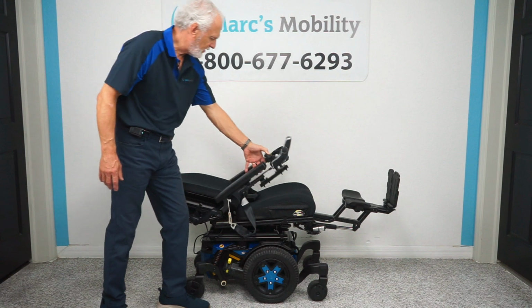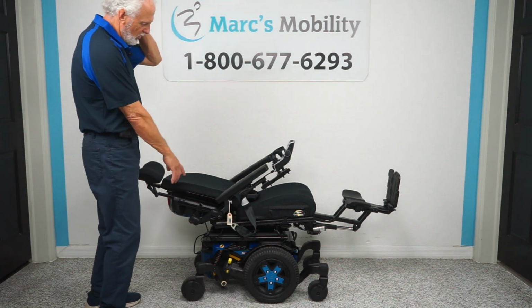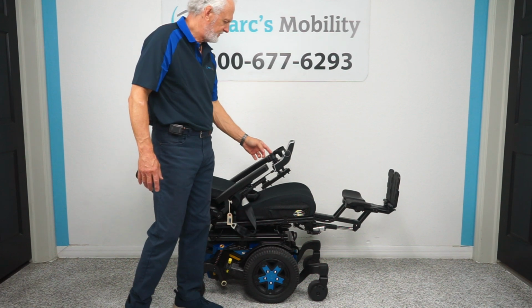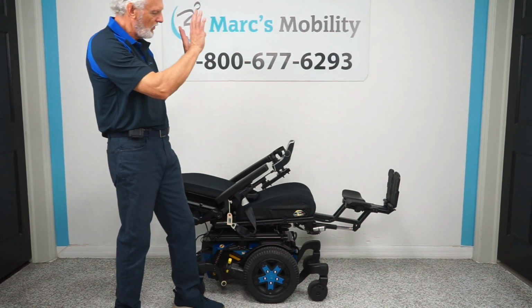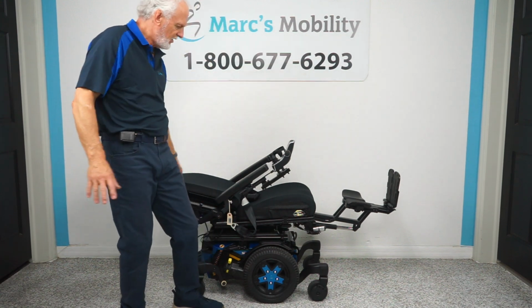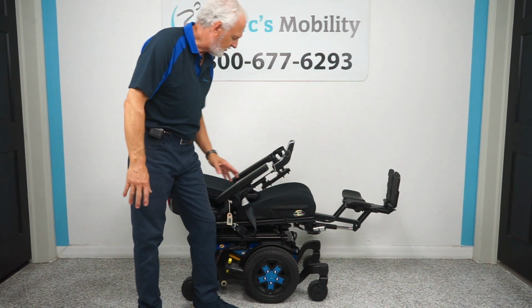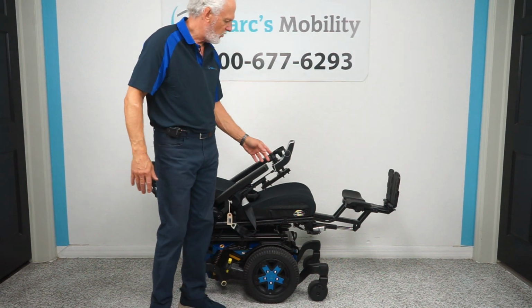So this is what it would look like if you're fully reclined in this chair, folks. If you want to be reclined more, you could just do this. You could tilt the seat back before you recline it. Then you can be more tilted back on your seat. Right now it won't tilt back until you bring the seat up, but if you tilt it back and then do the recline, then you'll be more reclined.